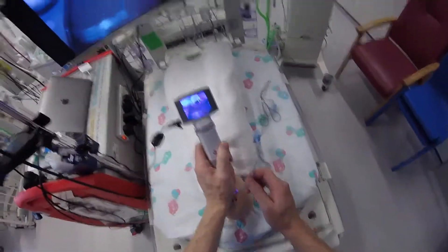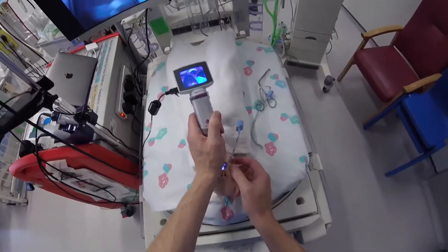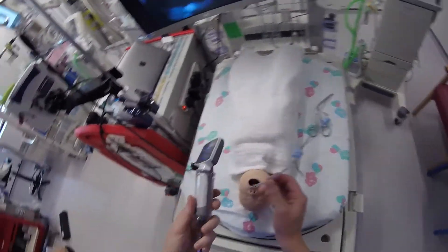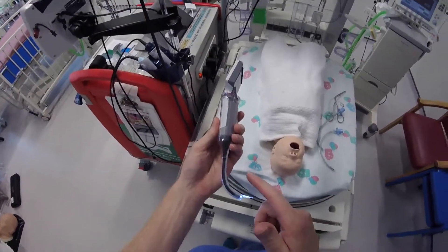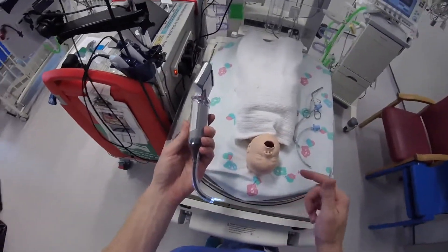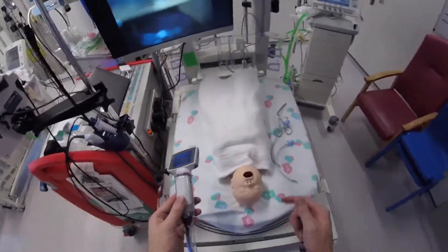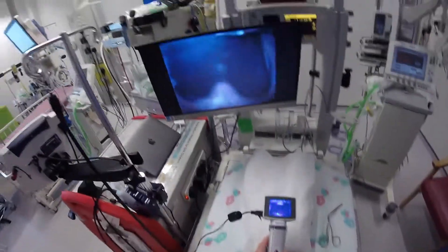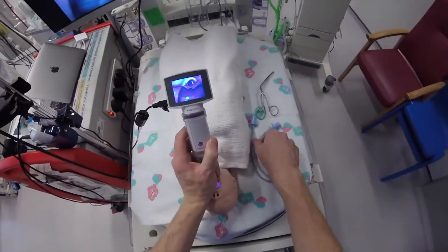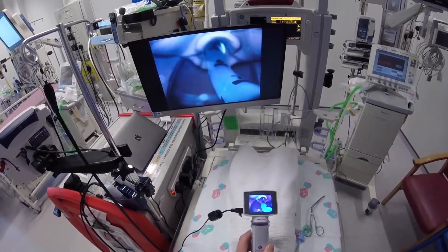If I go into the vallecula here, I've got a lot of control over this, and it's one of the nice things. Even though it is a hyper-angulated blade — normally one of the difficulties is getting the tube to the cords — with this KeenVision, it doesn't seem to be a problem. I can use this tube without a stylet and there's no difficulty passing it.